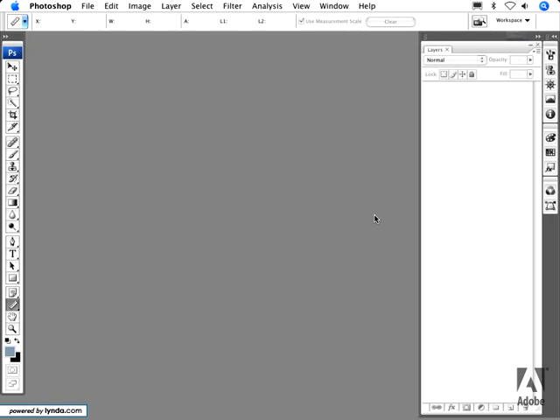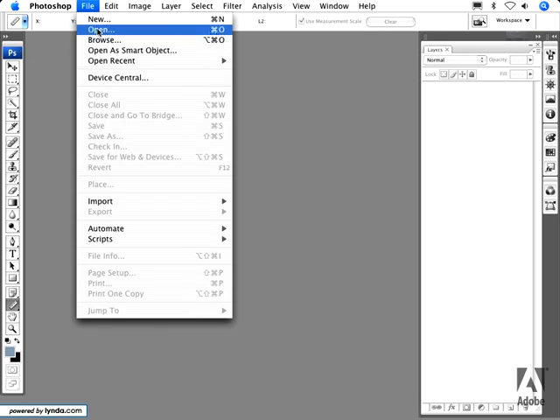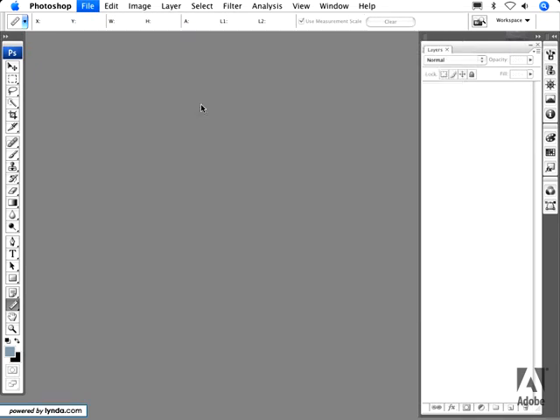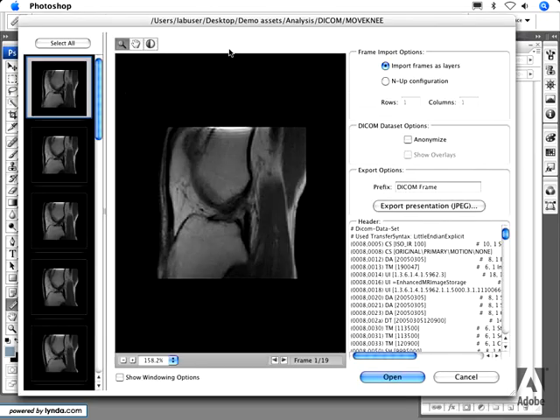You can now open and save DICOM files with Photoshop CS3 Extended. To open a DICOM file, simply go to File > Open and navigate to the file that you want to open.